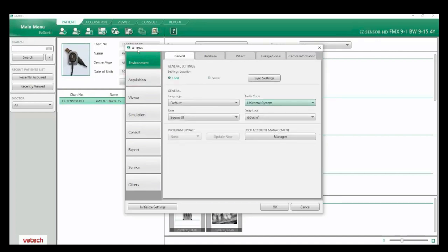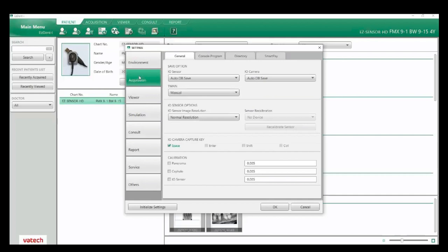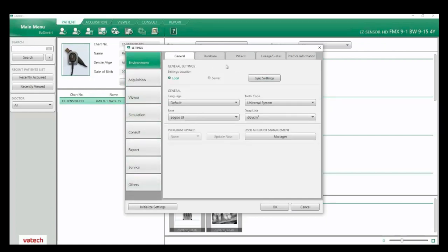One other thing we want to look at in our settings tab is the acquisition tab. Here we want to ensure that IO sensor is set to auto DB save, which will automatically save your images once you acquire them. If you're using an intraoral camera, I would select the same thing — auto DB save. There are a lot of other settings here we can look at in other training videos.